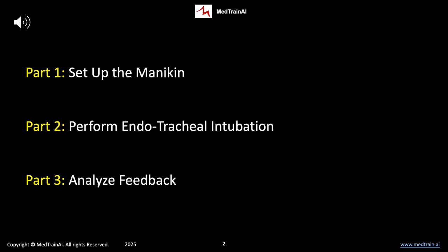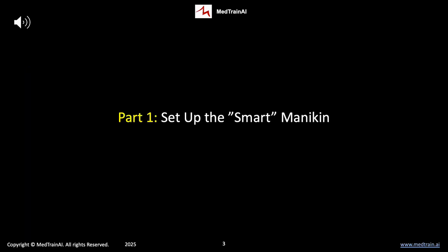Let's get started. First, we set up the mannequin. That's part 1. Part 2, we perform the endotracheal intubation. And part 3, we analyze the feedback. Part 1, set up the smart mannequin.